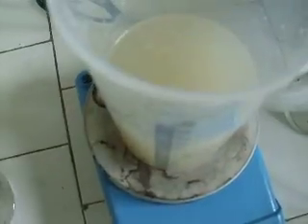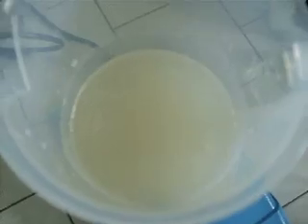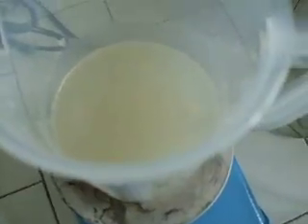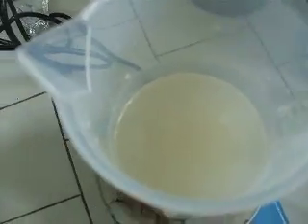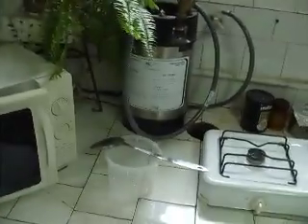There is one lump, so it was not perfect, not even at this time. And now the medium is so thick that the magnet no longer moves it. So the only way of taking it out is by pouring and by helping with the spoon. And here it is. Quite a dense mass of guar gum gel medium, which will be autoclaved.